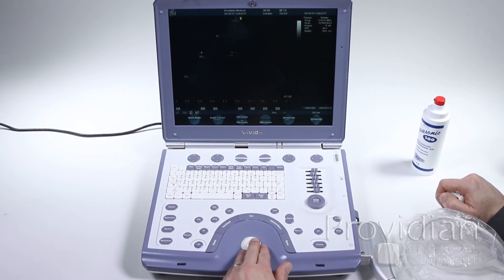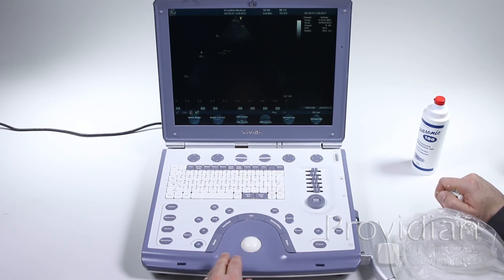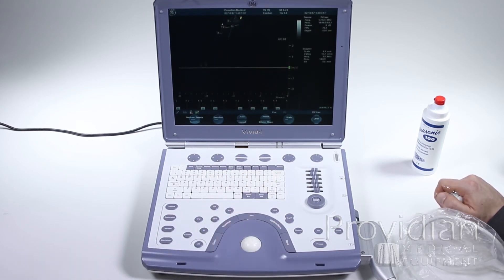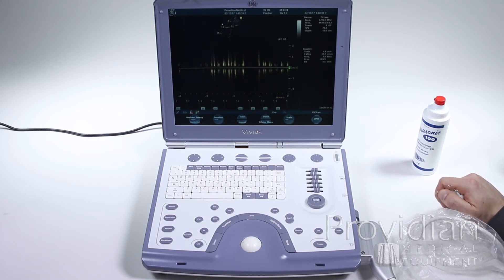Then you can use this trackball and scroll right over the area that you're looking to scan, and then you're going to press PW Doppler, and you're in PW Doppler mode.